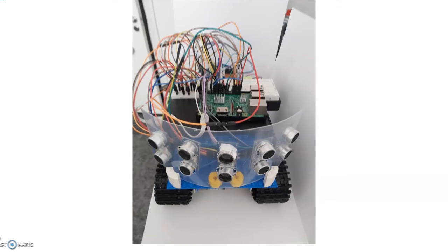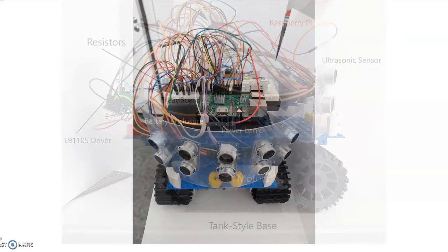The final prototype implemented 5 sensors in the front of the device, in the shape of a semicurve. It was designed this way to provide a wide range area for the device to check for distances and to check for objects in the front.